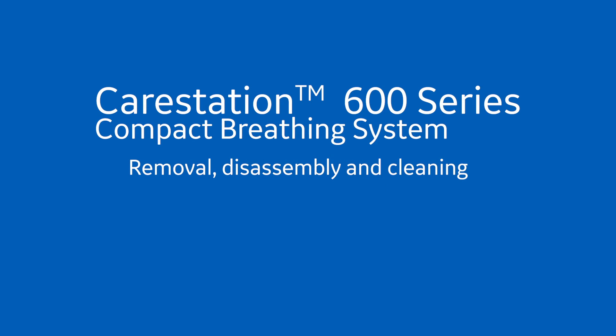Removal, disassembly, and cleaning on the Compact Breathing System for the CareStation 600 series. For more information, refer to the equipment's cleaning and sterilization manual.